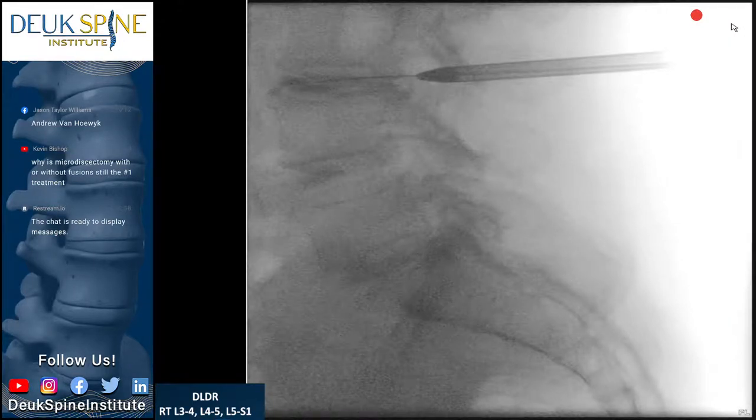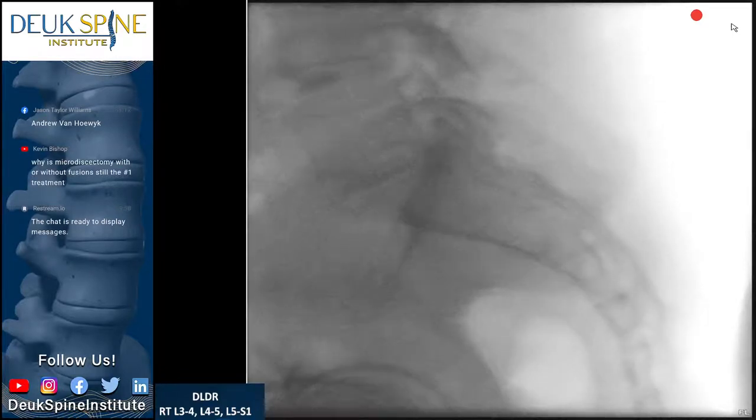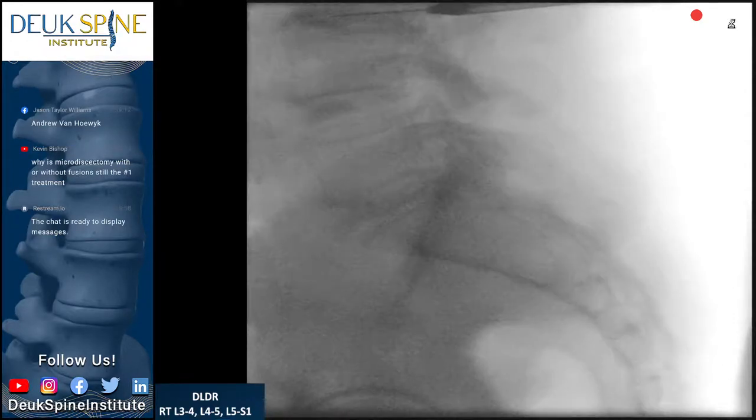Now, why is our picture so bad? What can we do about that? Let's see. I think you're way off on WAG. That's why you're seeing weird stuff. Remember, you want to be on the muscles. Muscles are here, not over here. Oh, boy. Let us know when you're ready. You're way overexposed. You're not WAGed in properly. Try to get it fixed. I'm gonna go get a coffee. Let me know when you're done.